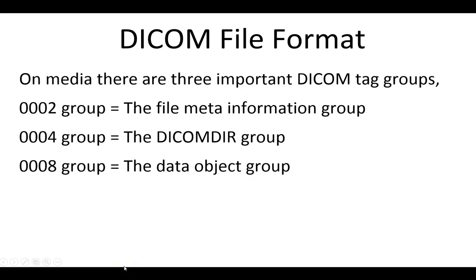Okay, so let's review the DICOM file formats on a DICOM CD. What we talked about with the CT scanner sending to the PACS archive was how chatty it was, how much communication there was, how much there was send this packet, take this packet back and forth. There's no back and forth when you put a CD into the CD drive. So how does that communication get done?